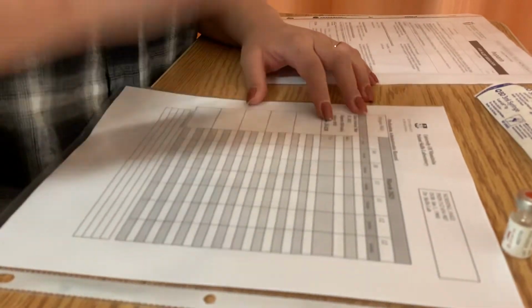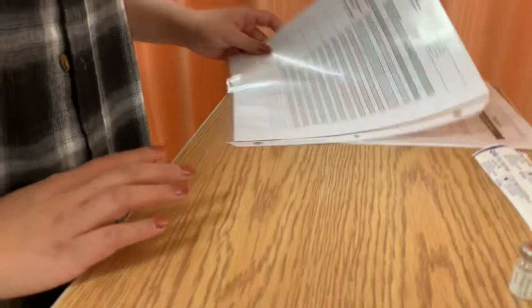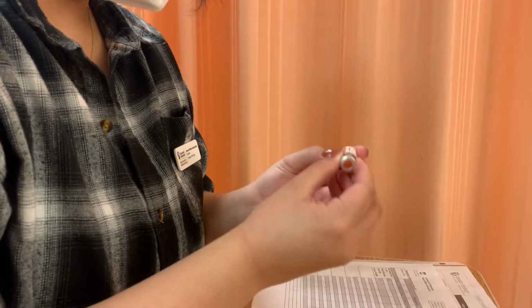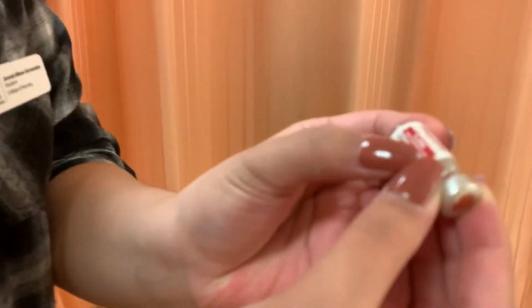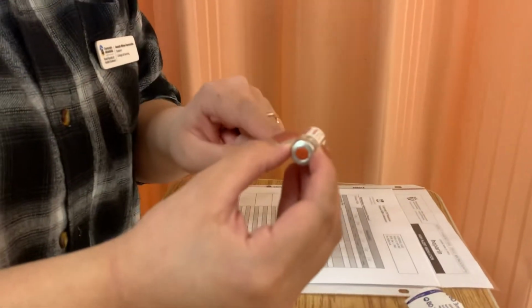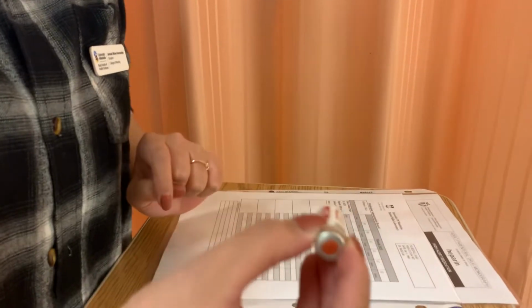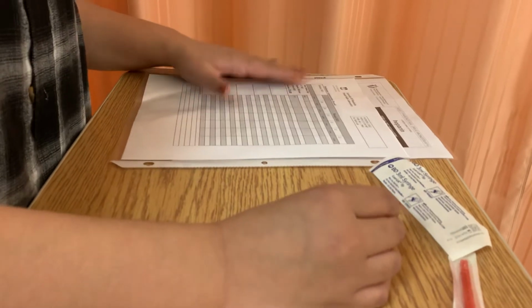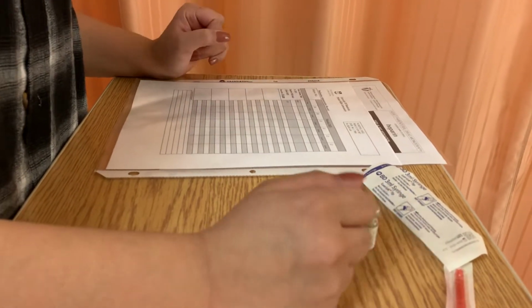Slot, and I see that there's 2 slots. First I'm going to get the medication. Okay, so this should be heparin, yeah, heparin, and it says here it's 5,000 units per 0.5 ml. So since I need a 5,000 unit dose, I will need 0.5 ml for my heparin. Okay, so have that ready.